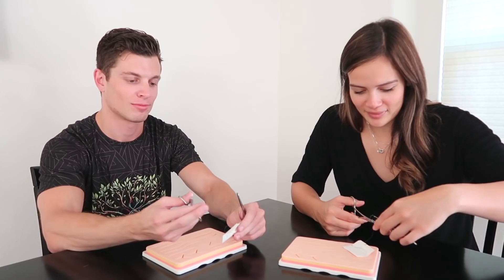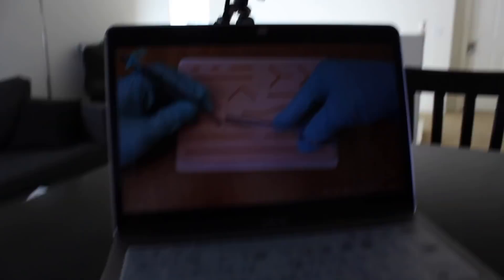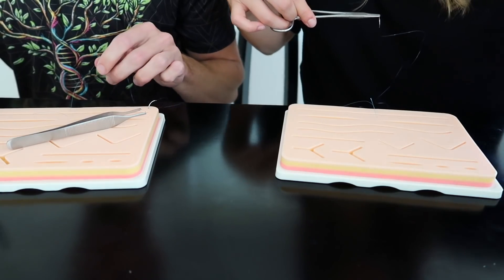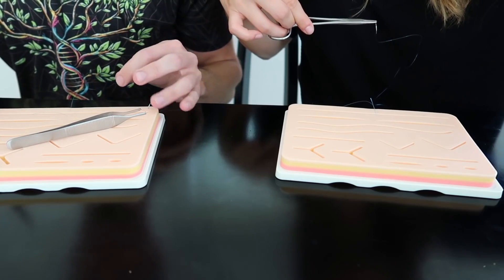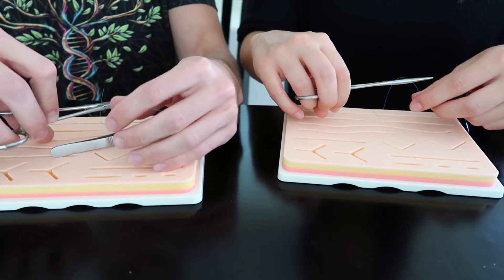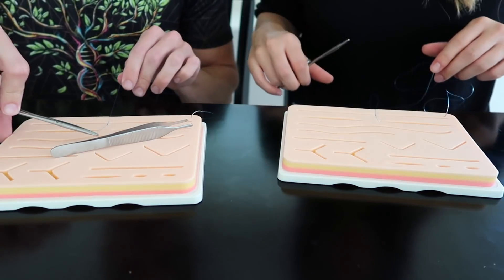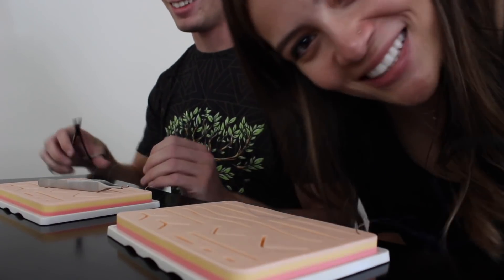And you can use the forceps to help you. Did I say I wanted to do surgery? Because I'm taking it all back now. This is supposed to be the easy part. So wrap around twice for a surgeon's knot. I did it! I did my first knot!